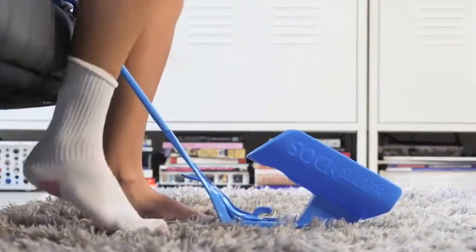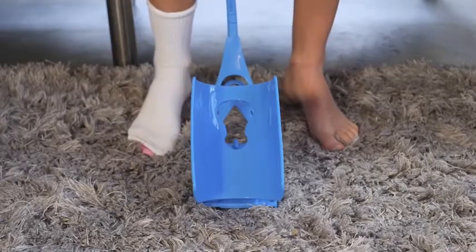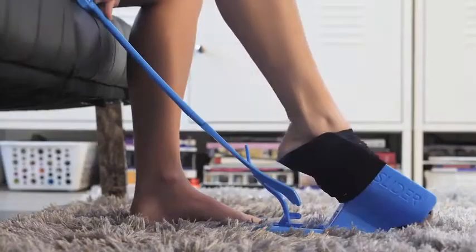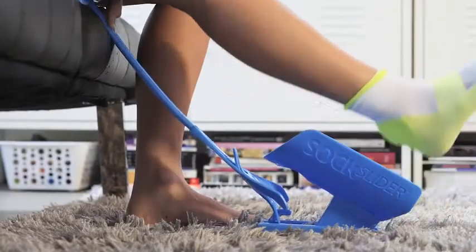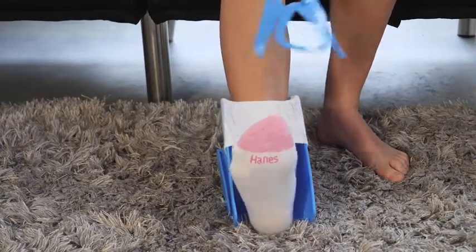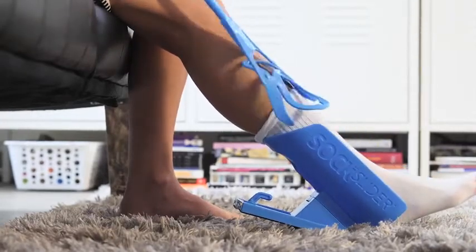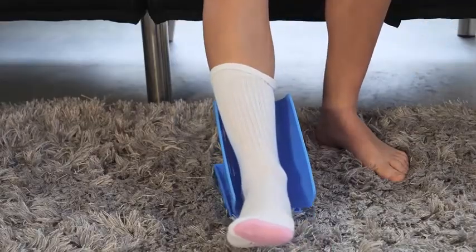If needed, use the handle to hold the Sock Slider system's cradle in place, as shown. Use the Sock Slider system with any sock, including tube socks and those tough-to-put-on compression socks. Use the lifting tab for compression and tube socks, located on the handle, to help pull up the cuff of your tube, compression, or other long sock.